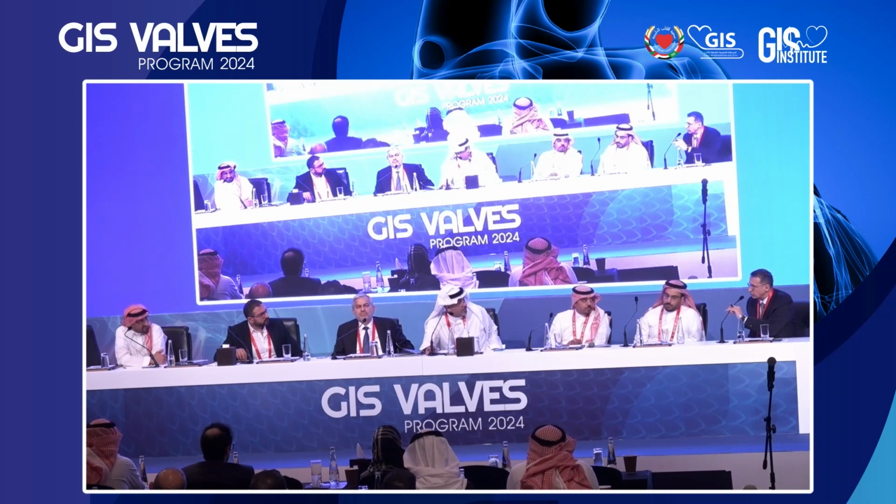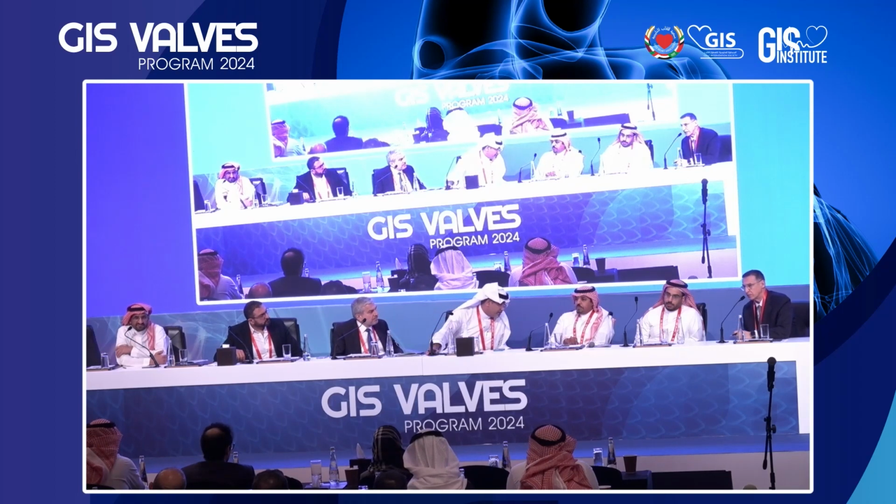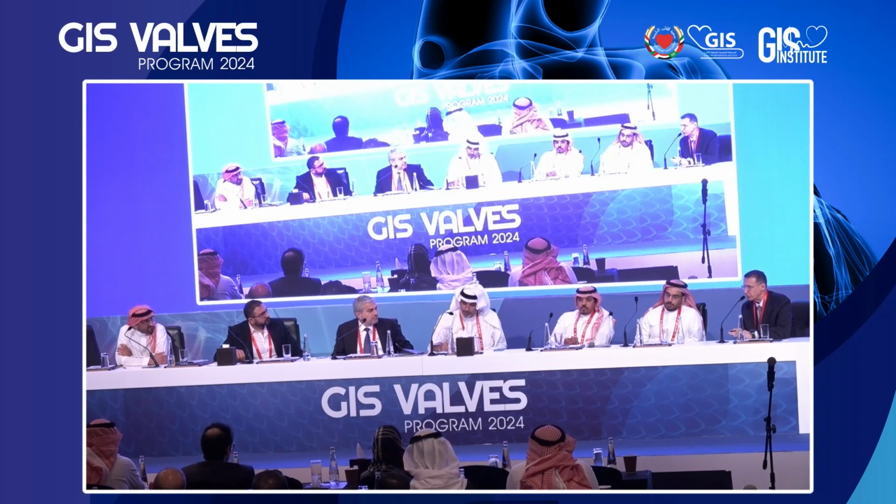I wouldn't do it again if we're using self-expandable technology. And if I'm using a balloon expandable, like pointed out by my colleague, I might use it to decide which of the two smaller devices I'm not going to use. So definitely undersize the balloon to eliminate a smaller valve and go with a bigger one.